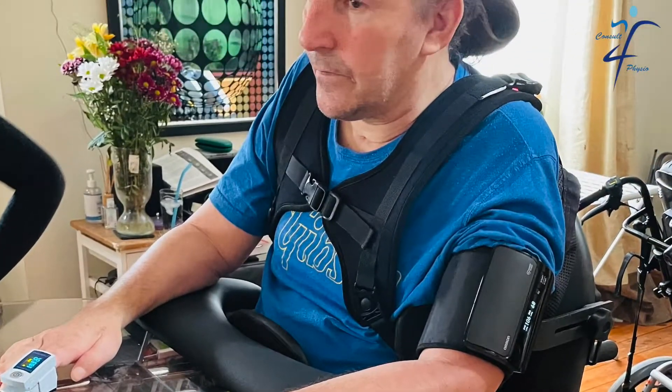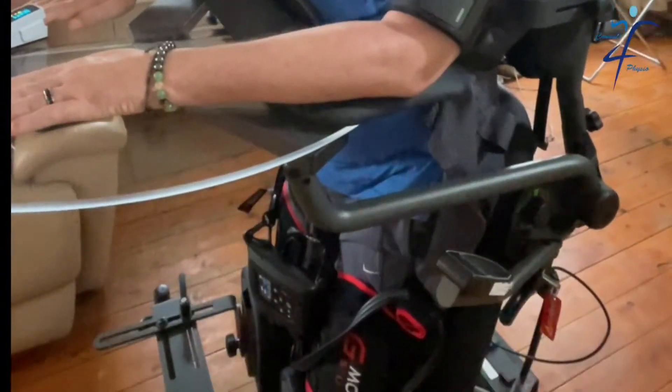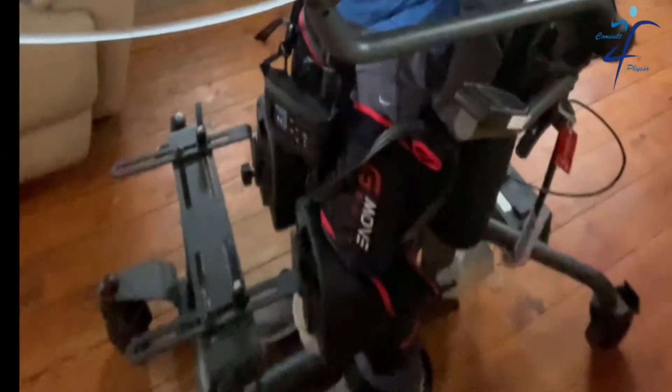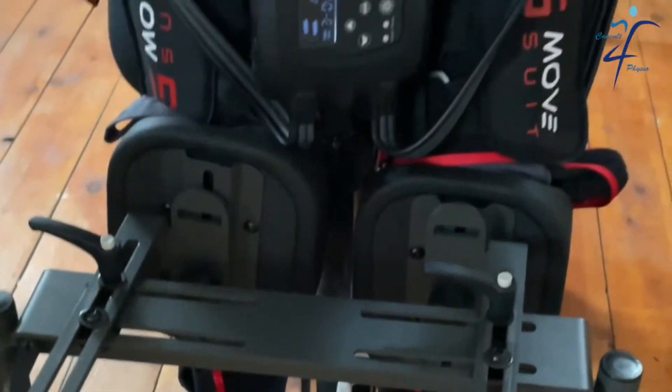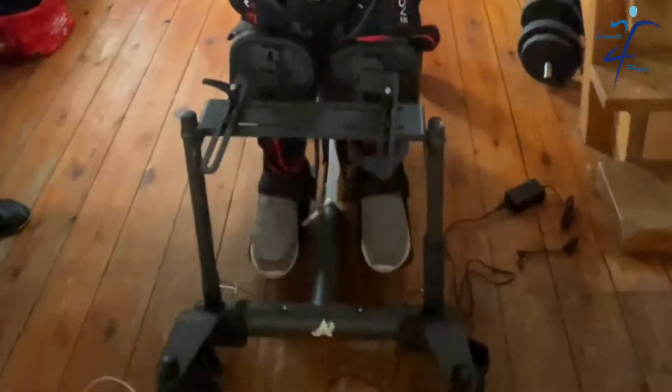Wayne had a spinal cord injury last year and struggles with postural hypotension. I've been trying to stand him up with a standing frame for the last eight months and it was very challenging. After reaching 50 to 60 degrees of standing, his diastolic blood pressure drops significantly, and at 90 degrees it often becomes unreadable and he gets extremely dizzy.